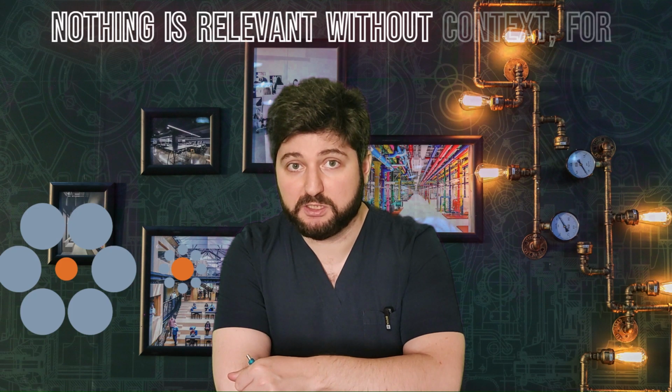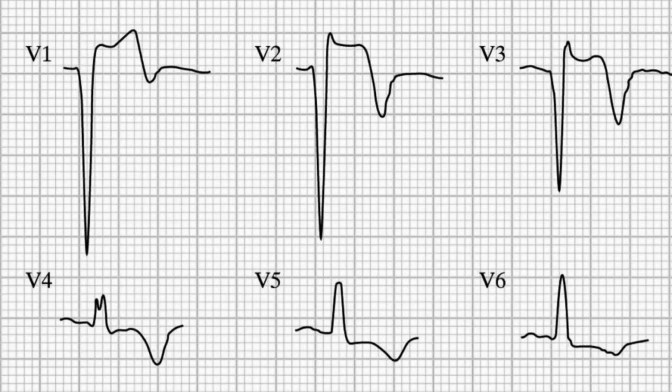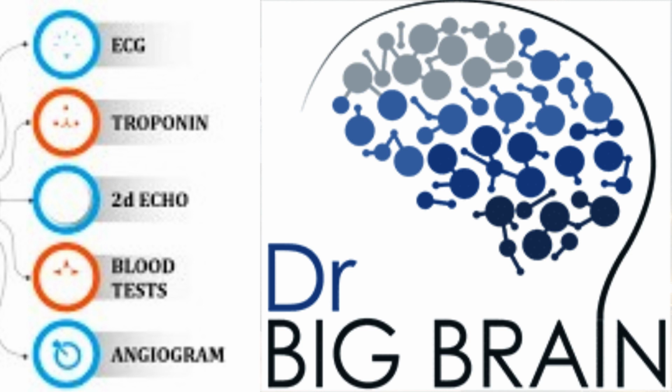Now, I want to point out, because it's the first video about ECG, that ECG itself is useless. A separate ECG doesn't give us anything. For example, this ECG can be showing myocardial infarction or nothing at all, nothing acute is happening right now. ECG is useful when the doctor has knowledge and experience and uses other diagnostic tools. Only that way can we use the full power of ECG. I want you to remember that. Otherwise it is useless.